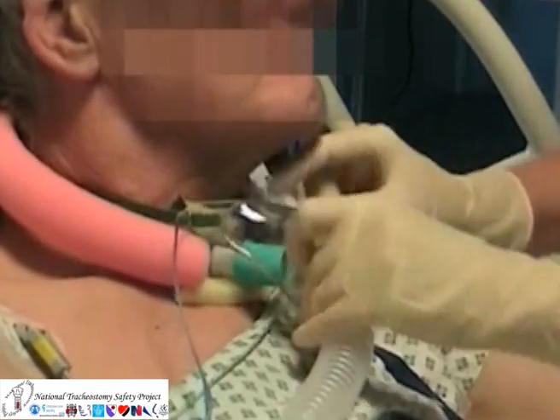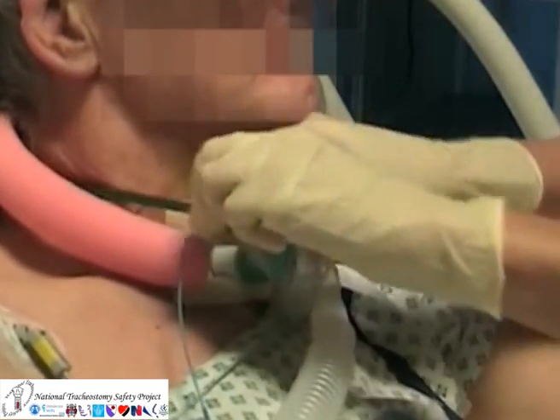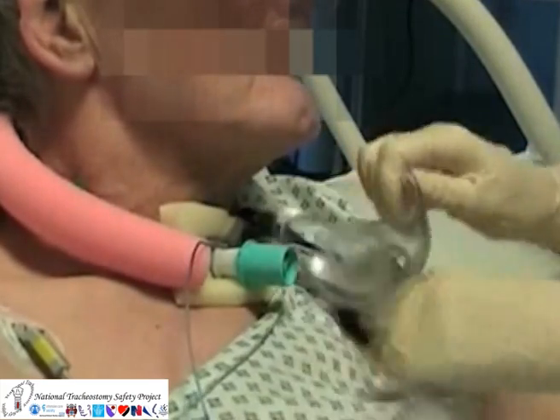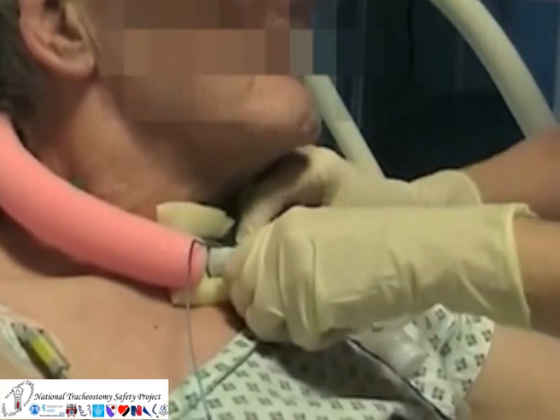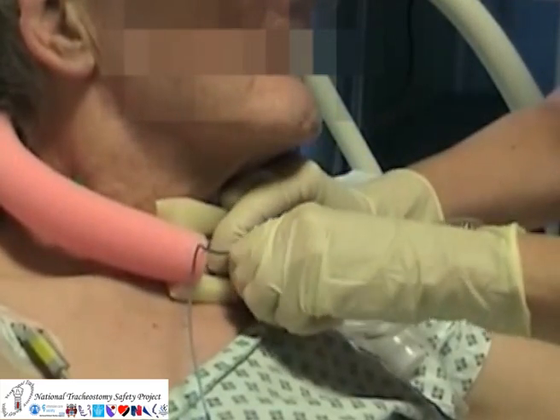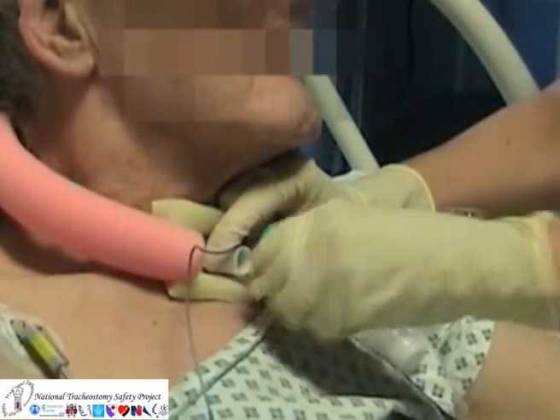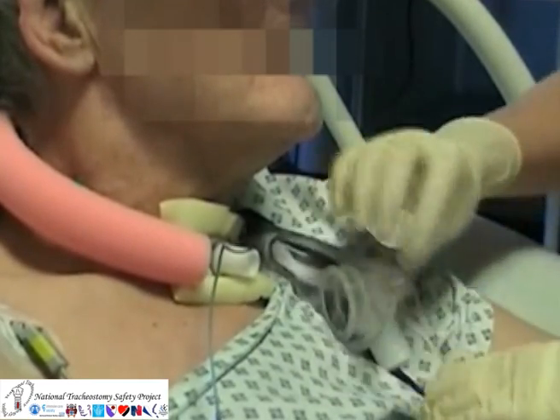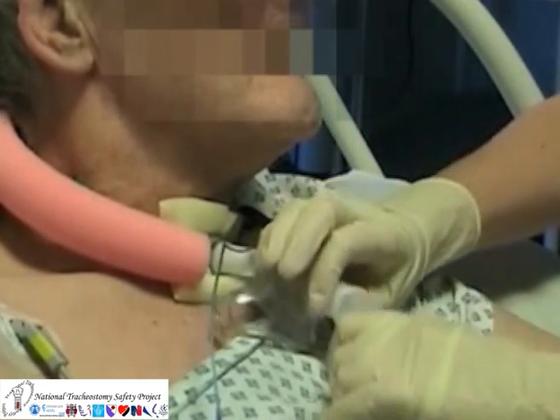Speaking valves, caps, HME filters, or any other devices which are attached to the end of a tracheostomy tube should be removed if the patient becomes distressed.